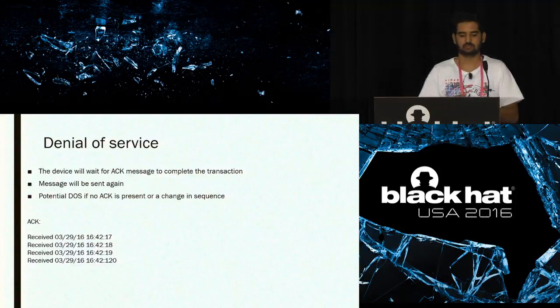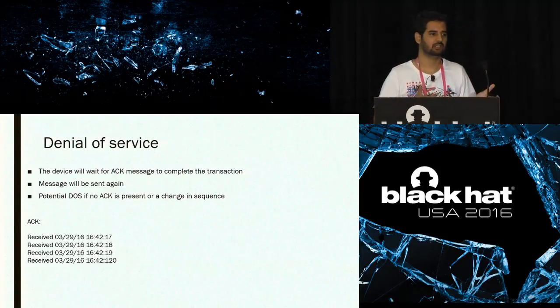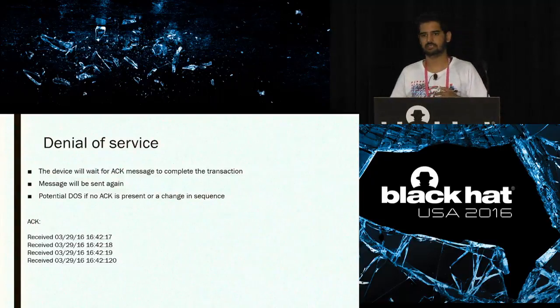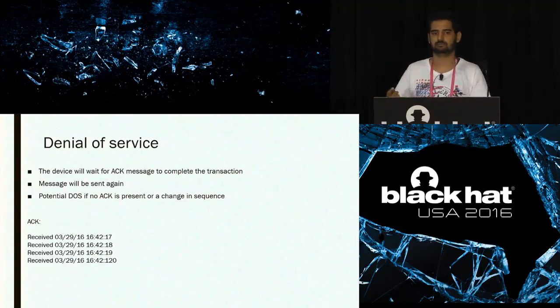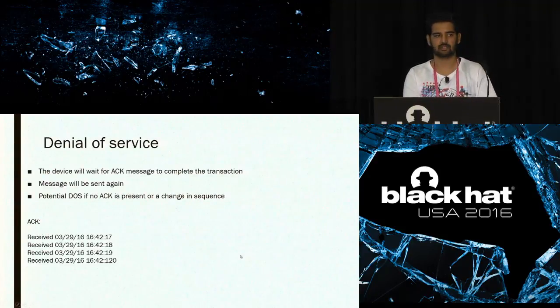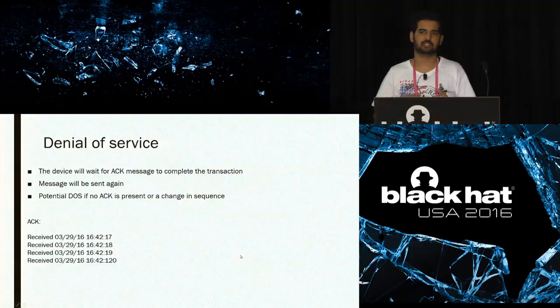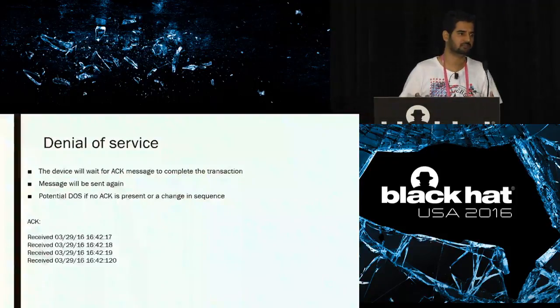The other problem is, what if I do not send any acknowledgement at all? What if I own the server and I stop sending acknowledgements? Now, what happens with any system is it'll send the message again. So let's say you have a patient monitor which is sending your blood pressure updates, and I'm sending an acknowledgement which looks like this. The patient monitor thinks that the message is not complete, so it will send the message again and again and again.